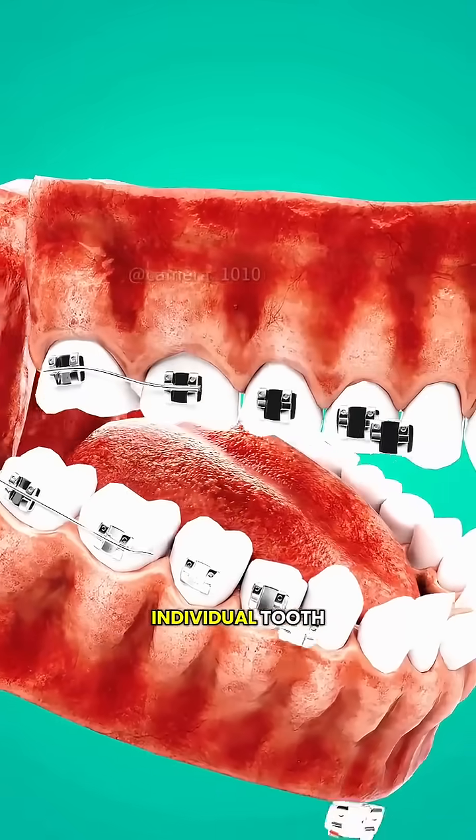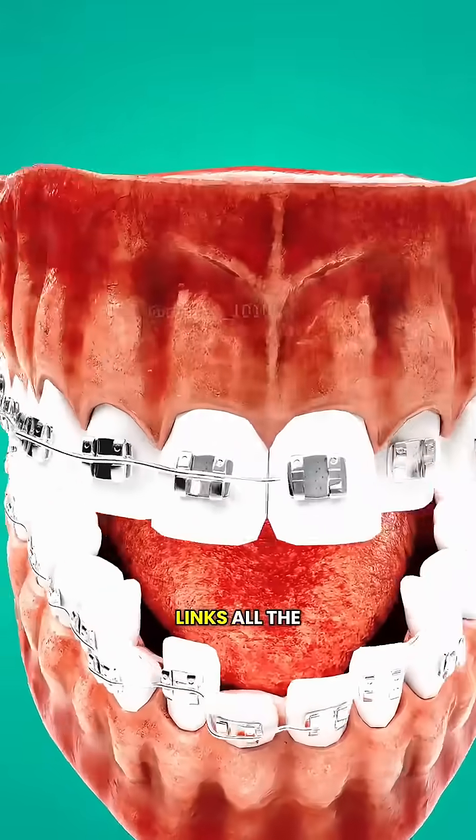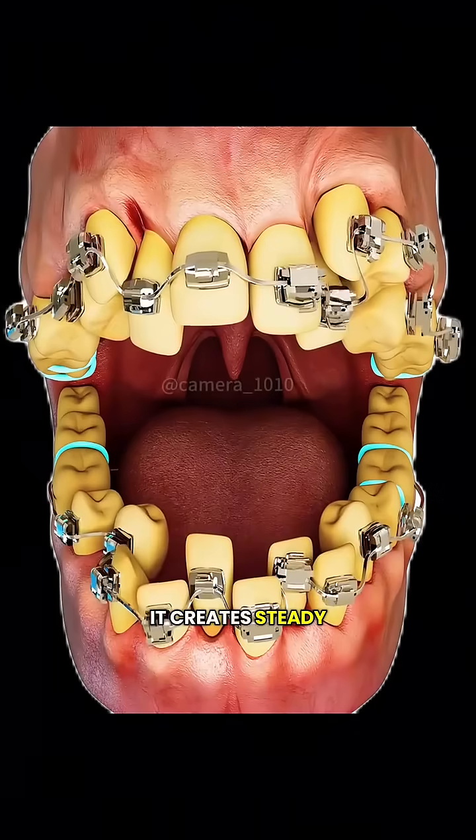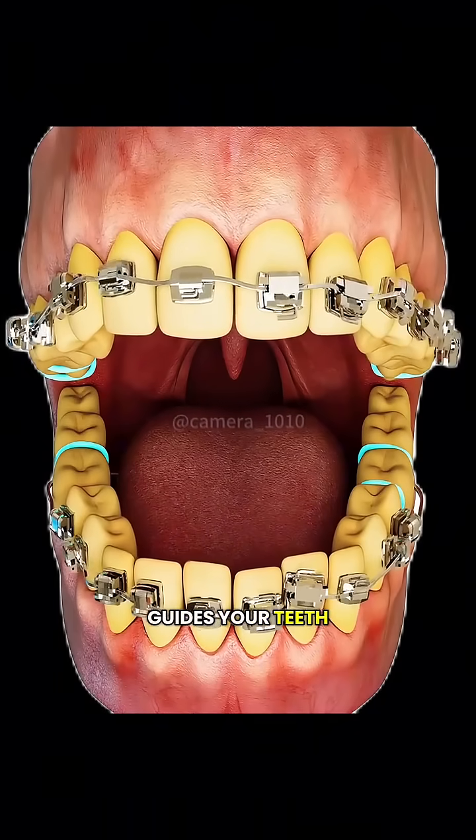Each bracket is bonded to an individual tooth, and the arch wire links all the brackets together. When that wire gets adjusted, it creates steady, gentle pressure that guides your teeth toward a new position.